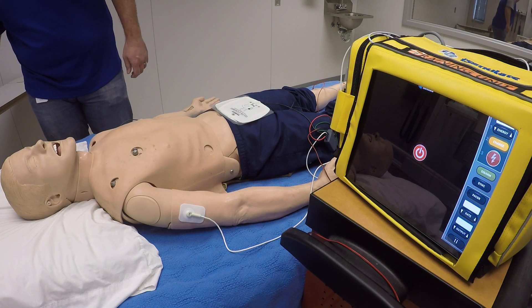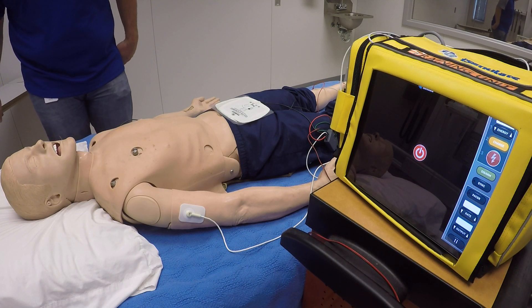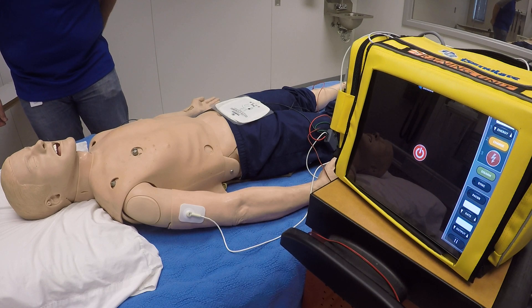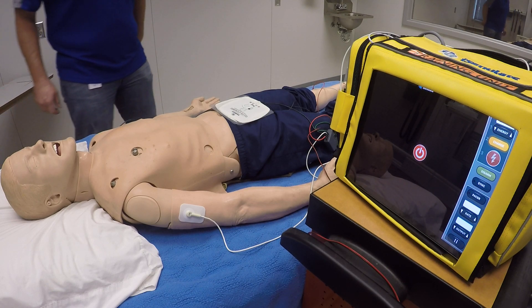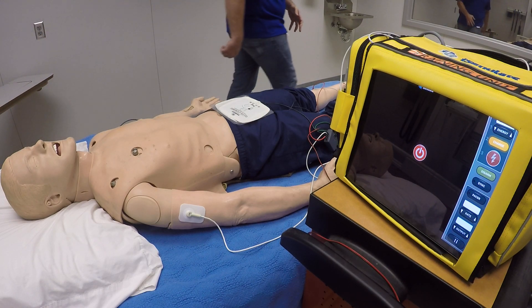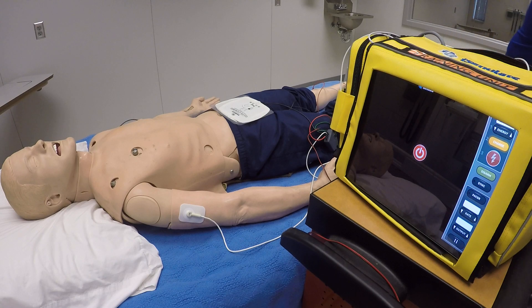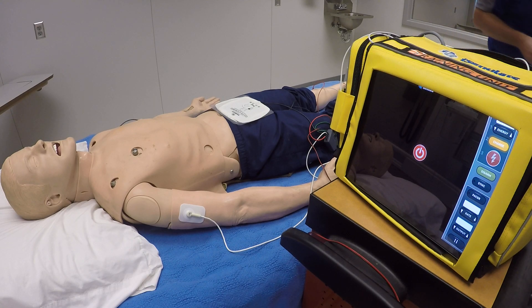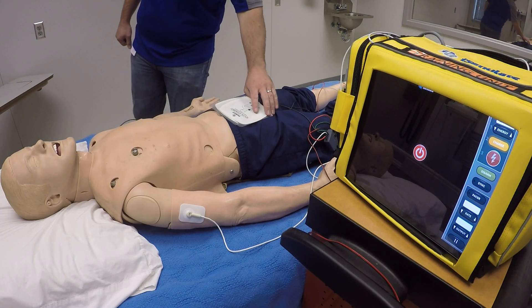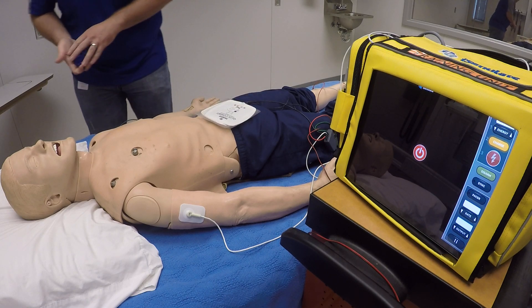This is synchronized cardioversion. First thing I want to do is make sure we have all of our equipment here. We have a monitor with defibrillator and those defibrillation pads. Our patient is hooked up to a four lead EKG, and here are our defibrillator pads.